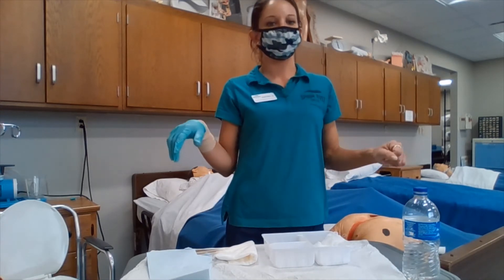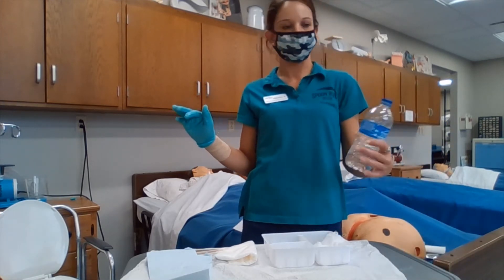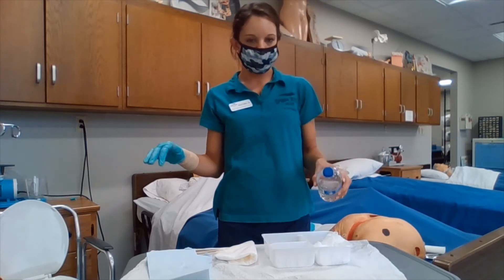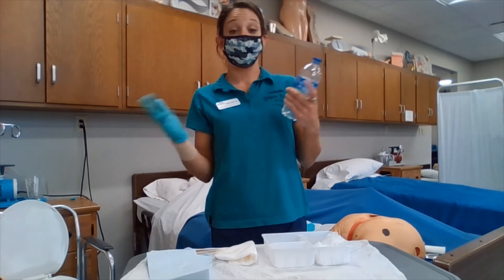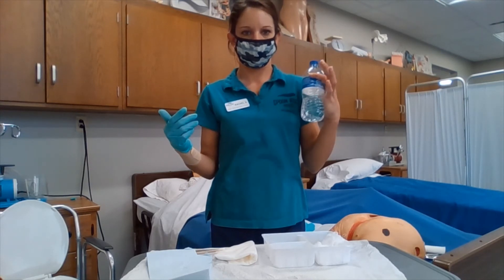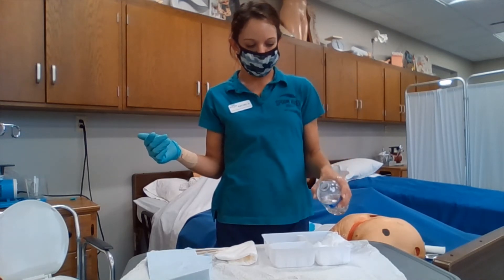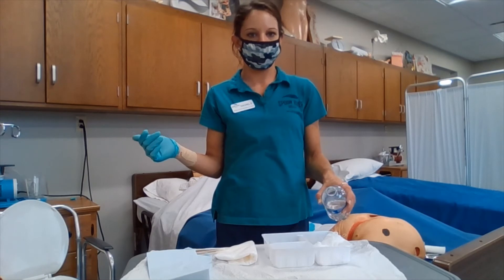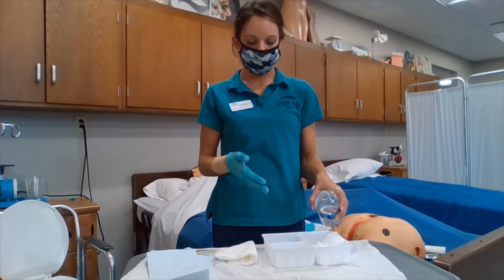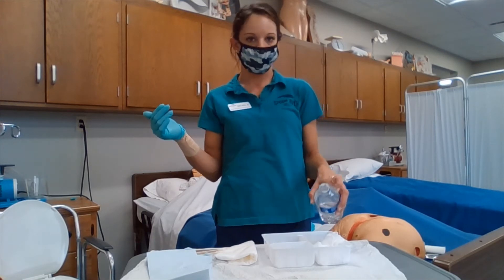Next would be the pouring of the solution. I am going to take my ungloved hand and reach around without crossing my sterile field. I am also going to ensure that the label is in my palm side. Then I am going to pour the solution, making sure that I am about four to six inches away — that ensures no splashing and also ensures that the tip of the bottle is not touching our sterile field.